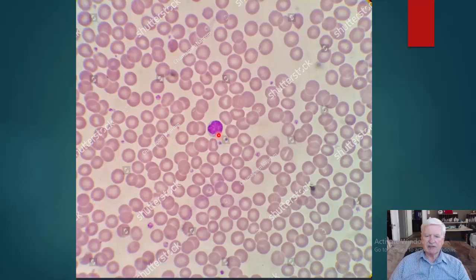And then we see a single lonely white blood cell here, showing that the red blood cells are about 1,000 times as numerous as the white blood cells. And then this is probably a monocyte. They're hard to tell apart, but I said it backwards. This is probably a lymphocyte because the nucleus is taking up the whole volume of the cell, almost.